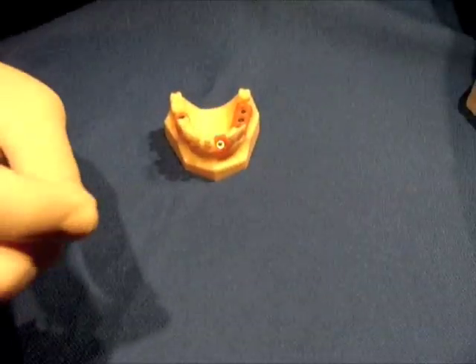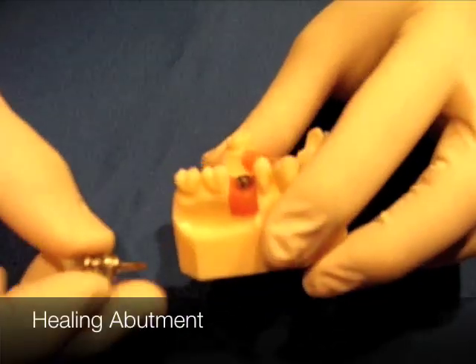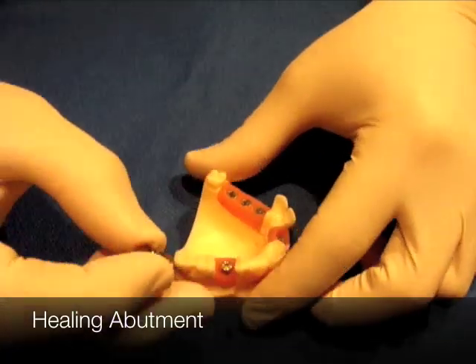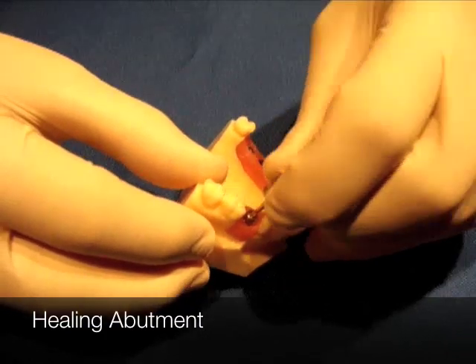You want to use the shortest driver possible, but your patient may come back from your surgeon looking like this. What you're going to do is take that healing button off.